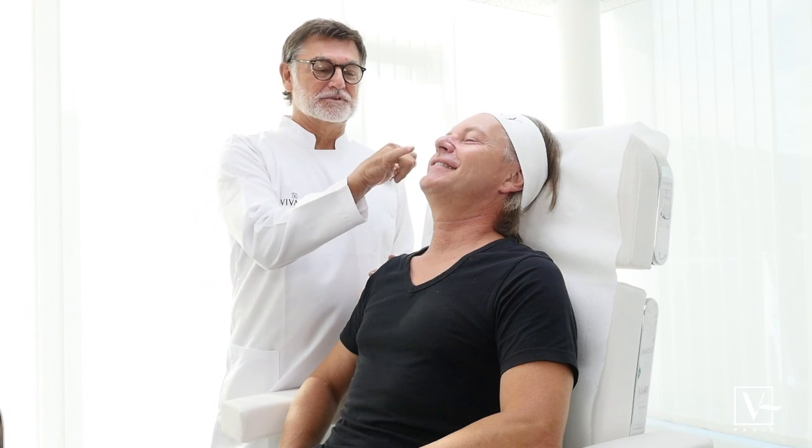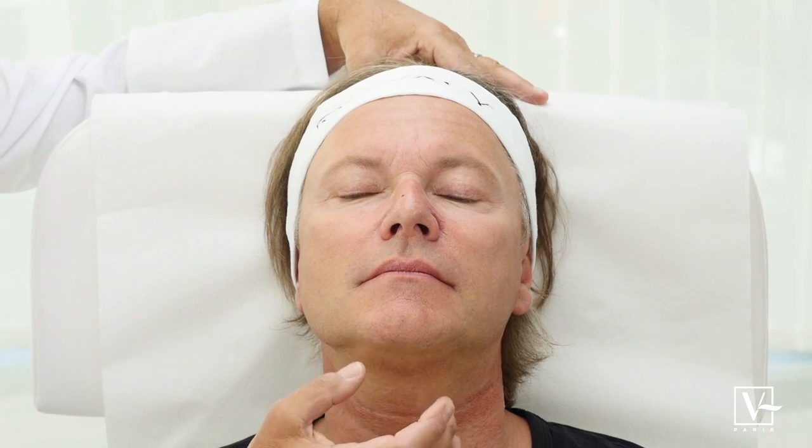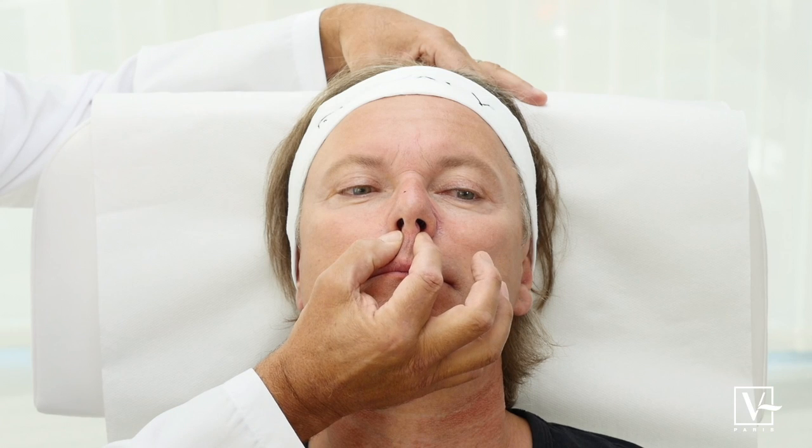Dan complained about his nose, which is drooping a bit. We are losing bone on the nasal spine and a little bit on the radix, which is the nasofrontal angle. So goal number one will be to lift the tip, to project the tip, by injecting some Stylage on the nasolabial angle.